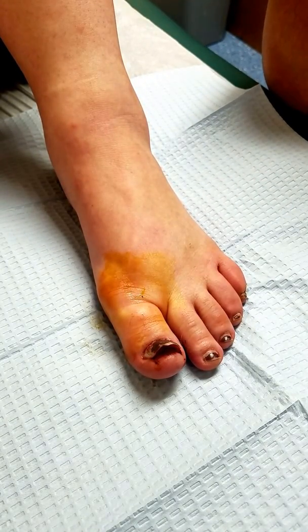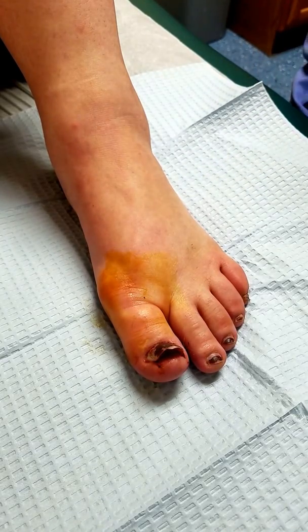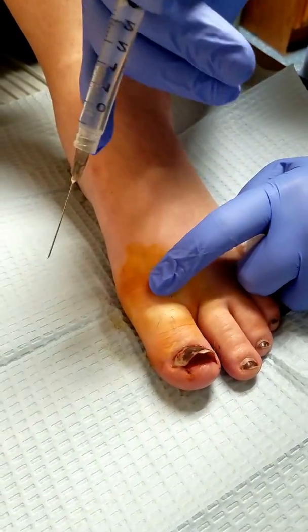I'll give that a little bit of time to work, and then I'll give you a little bit more numbing medicine but a little bit deeper.